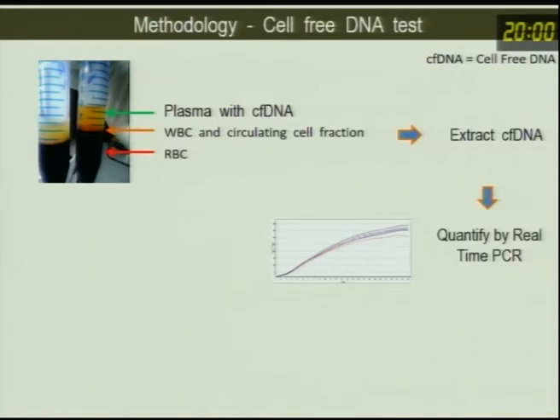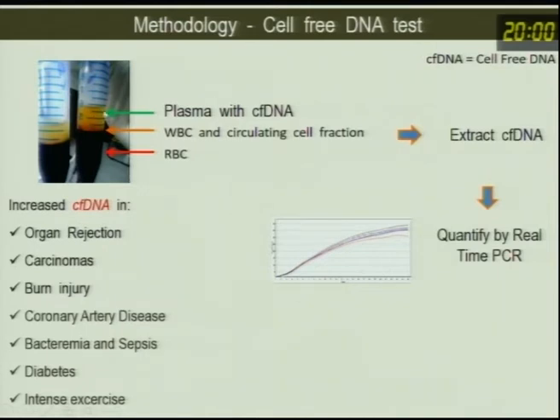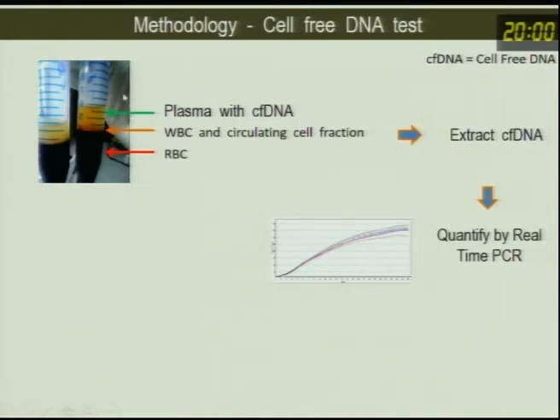It's called apoptosis, right? So they will wither out into the bloodstream, and the cell membrane breaks open, and the DNA content is released into the plasma. So the DNA is no longer inside the cell. That's why you call this a cell-free DNA test. Once the blood sample reaches my lab, I will collect the cell-free DNA from the plasma.